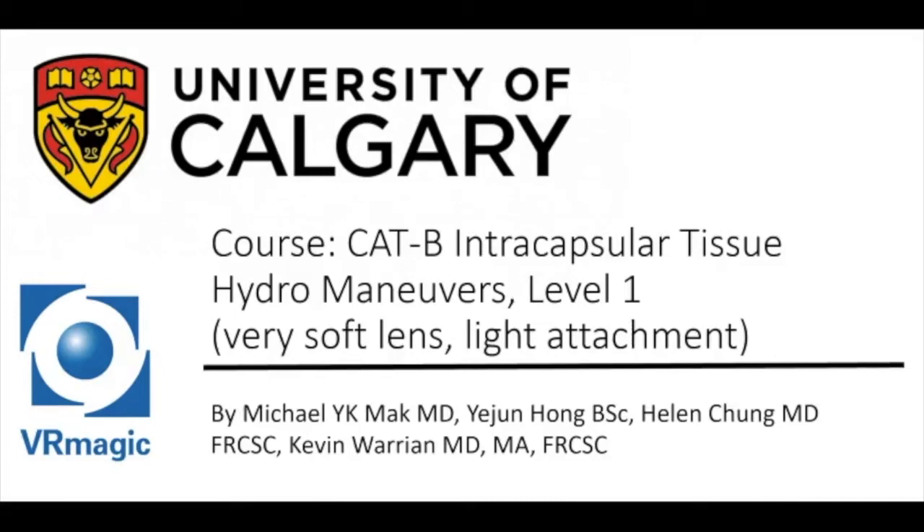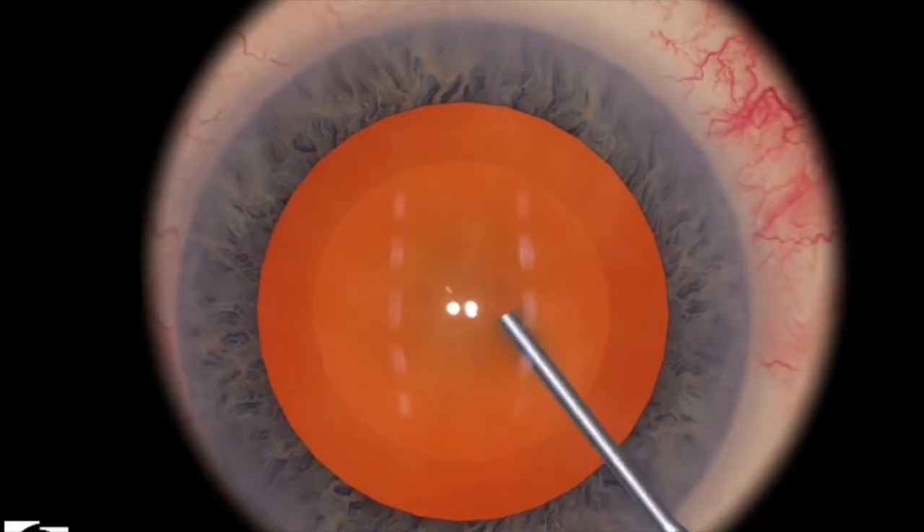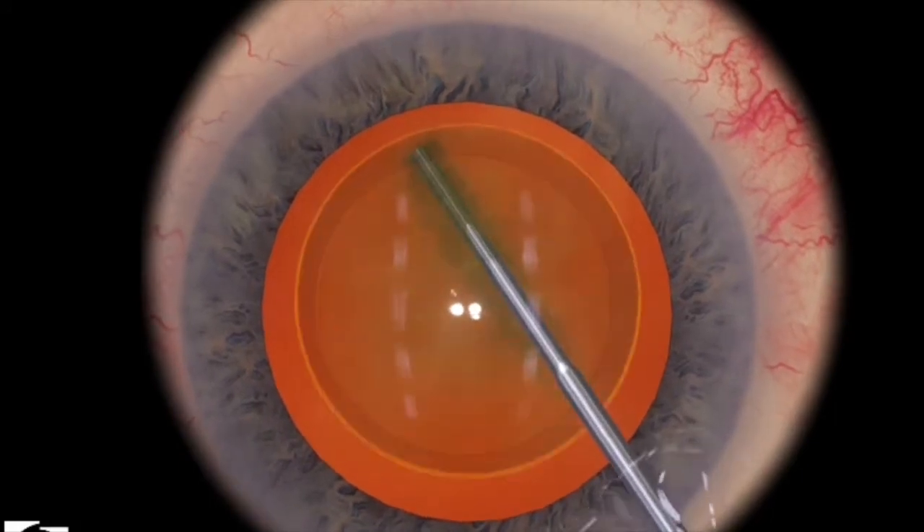Hello, my name is Dr. Michael Mack. I'm one of the residents here at the University of Calgary, here to explain Cataract B Intracapsular Tissue Hydro Maneuvers Level 1. In this particular level, you're switching gears from creating capsulorexis in order to practice hydro dissection and hydro delineation.